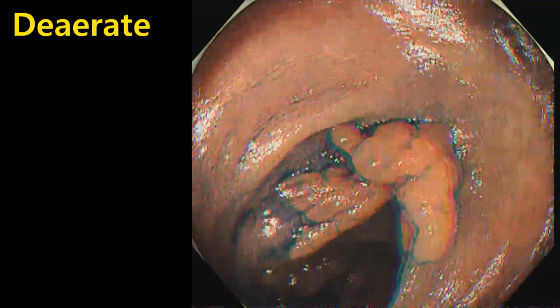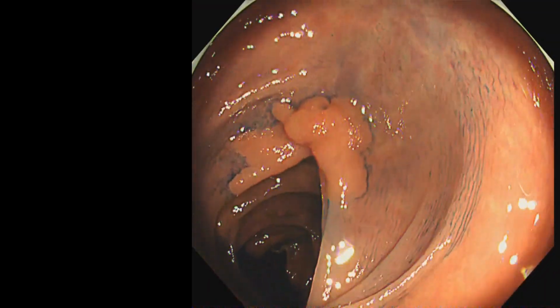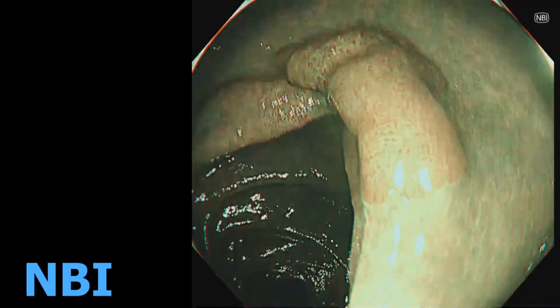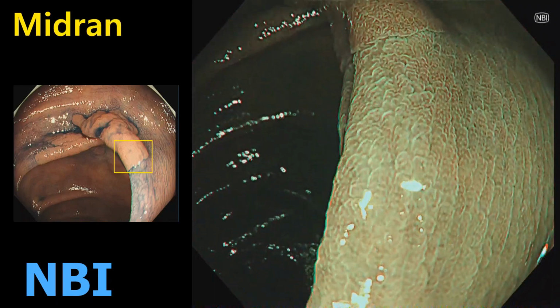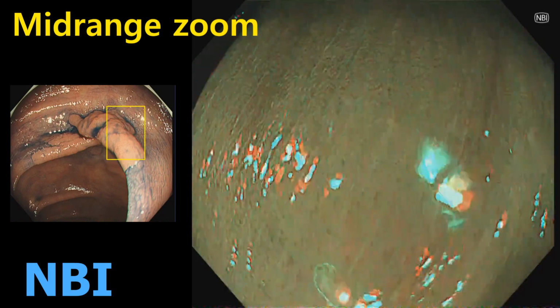Finally, crystal violet is stained on the region. Stain the region in a slow, gentle drop-down motion. Then, wash with water to remove dirt. Observe the pit pattern, and I diagnose 3S, 3L, and 4 pit pattern.